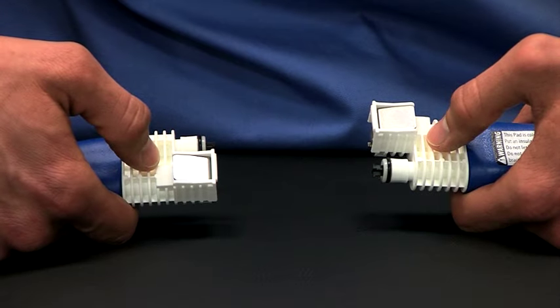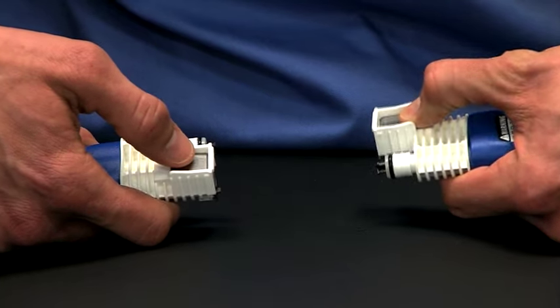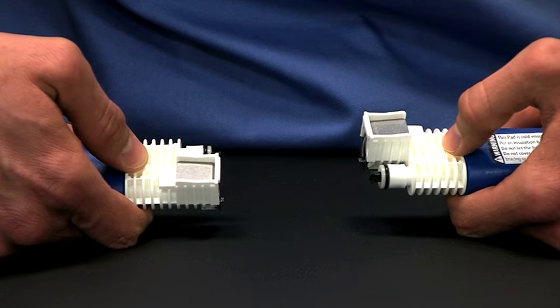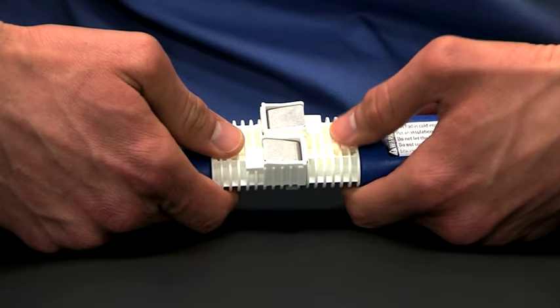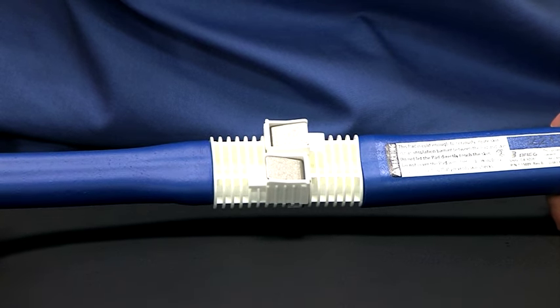The next step is very important. Before connecting the pad to the unit, push down the metal tab on each connector. You will hear each click when you push them down. Firmly push the unit and the pad together. You will see the two metal tabs pop back up and hear the clicks. If you force the unit and the pad together without depressing the metal tabs first, you may damage the connector.